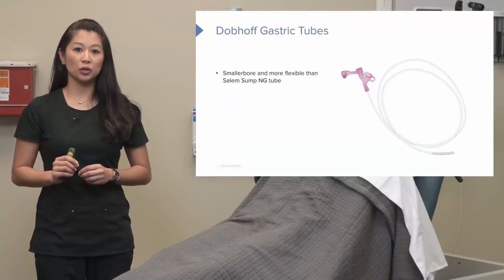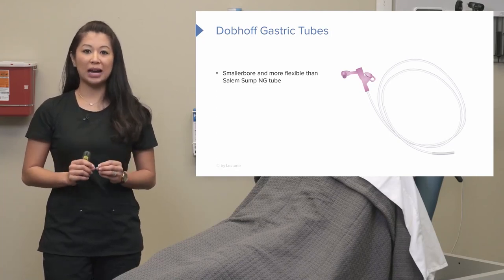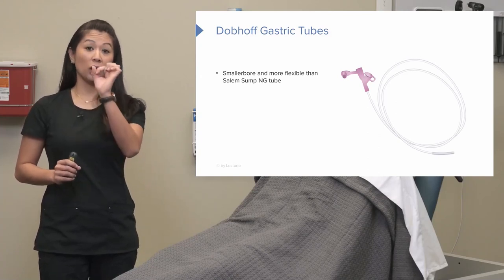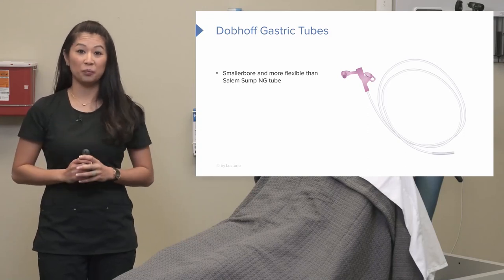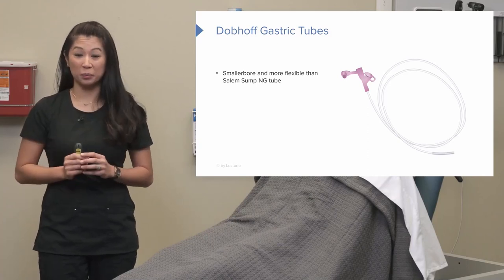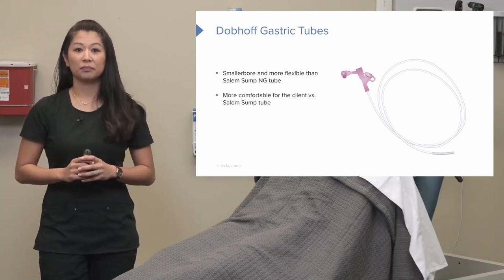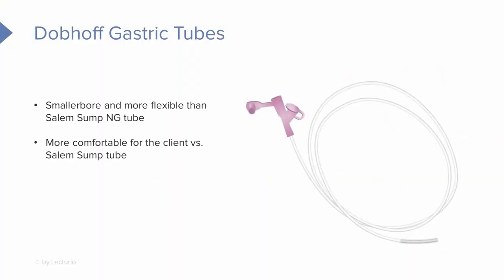Now let's take a closer look at the Dobhoff gastric tube. This is a really special type of NG tube. It is much smaller in circumference and much more flexible than the Salem Sump tube. As a nurse, this one is way more difficult to place because it's very thin and a lot more flexible. The nice thing about a Dobhoff tube is that it's definitely more comfortable for your patient than the larger Salem Sump tube.